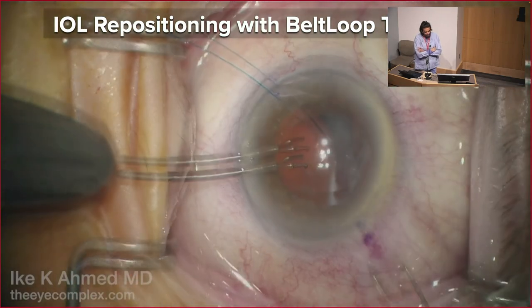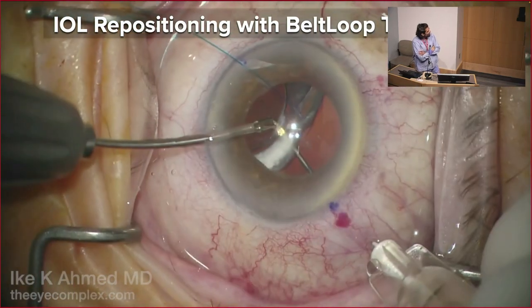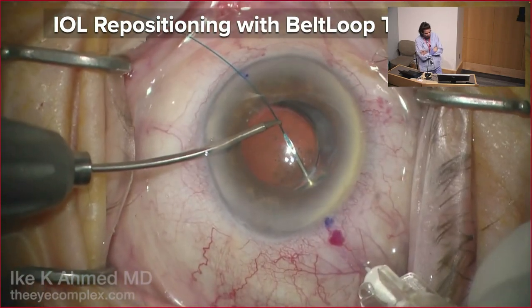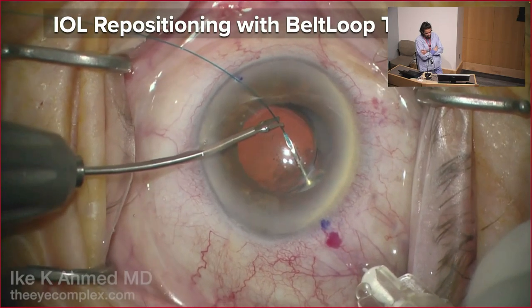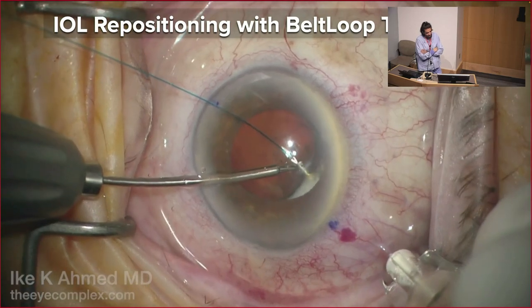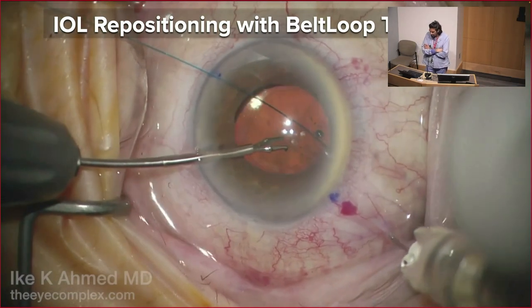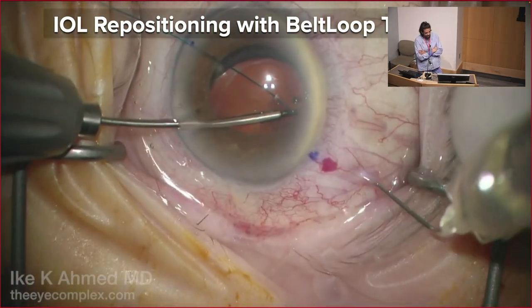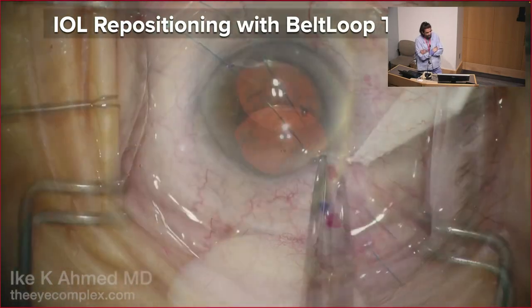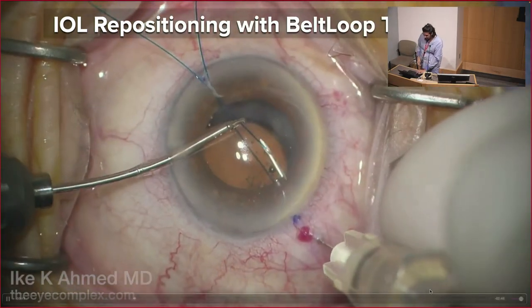And this is particularly useful, for example, if there really is no capsule or bag present, if the lens is not amenable for suture loops, or if we wish to use an alternative to Gore-Tex and not have to open the conjunctiva. So here's a 30-gauge, that same TSK needle that we saw for the Yamane, feeding in, in this case, 6-0 Prolene through the lumen of that needle. The challenge, of course, is getting that needle through that optic without that optic twisting too much and pulling out, of course, there's traction. So holding that capsular bag, if we can, without tearing it is important at the rexis edge. There's the second pass made above that.